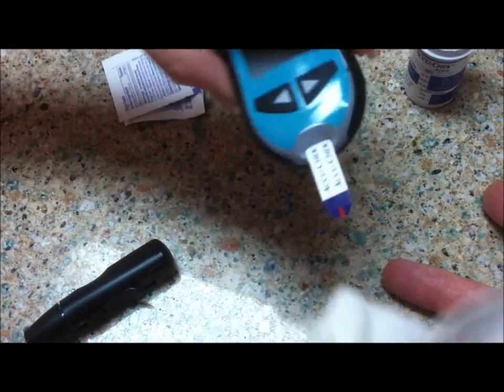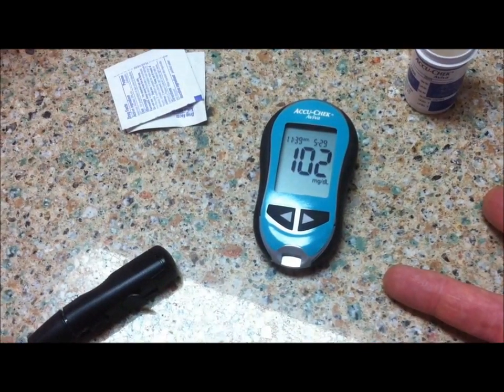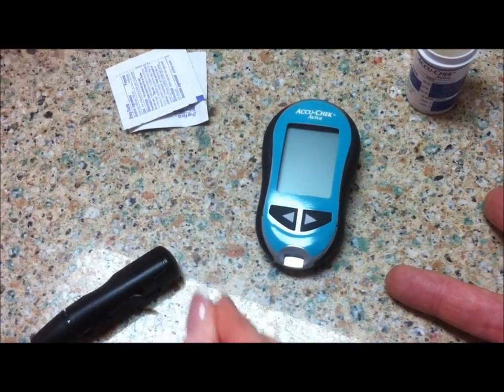And then you just take the strip, remove it, and dispose of it in a sharps container or a trash can.